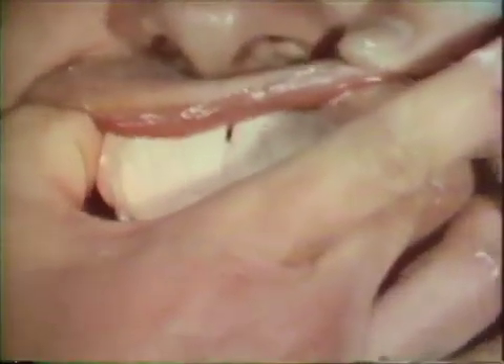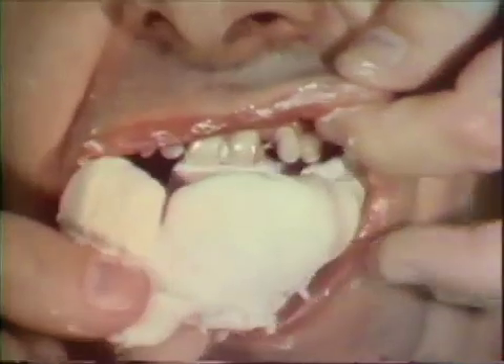The impression is again placed into the mouth and fully seated. An elastic impression material, in this case alginate, is carefully loaded into the labial vestibule. This will prevent voids made by trapping air at either side of the frenulum. The loaded anterior portion of the tray is delivered to the mouth. The tray should be fully seated. The index finger is inserted through the central opening and the first portion of the tray is held in position in contact with the supporting tissues. The lip is drawn down over the flange of the anterior portion of the tray. After the alginate has gelled, the impression is removed from the mouth.